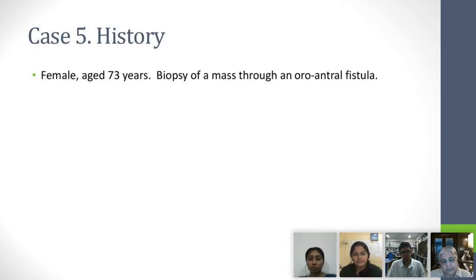Passage eventually gets epithelialized, and then we get this fistula, oroantral fistula. So what I think Kshitija has learned is this oroantral fistula is not just some fistula that you get anywhere between the maxillary antrum, whether it's the palate or some other place. That it is actually almost always in either the premolar or the first molar tooth.